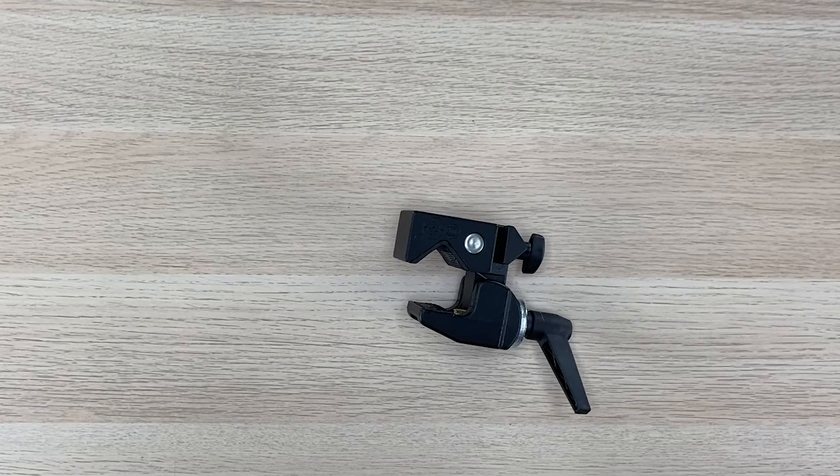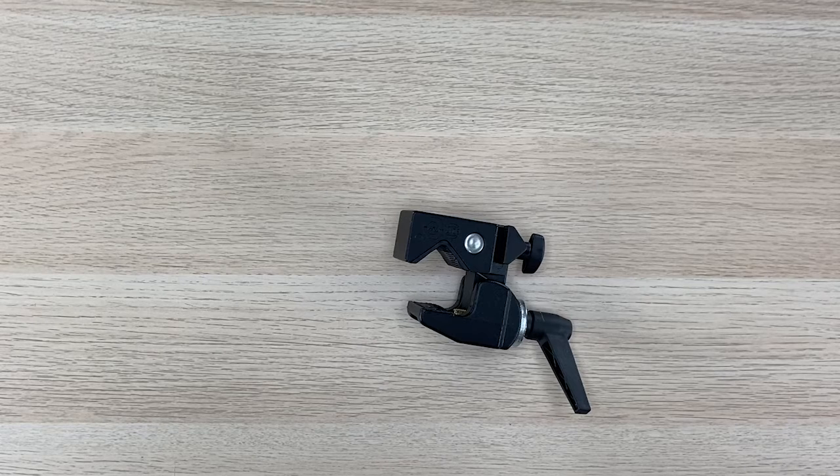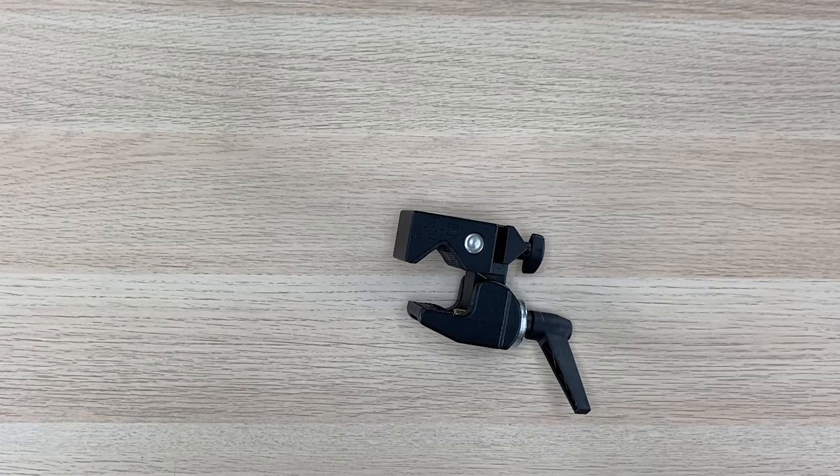Hi, my name is Jason from AbleNet. Today I'm going to give you a quick overview of the super clamp that goes with our mounting systems.